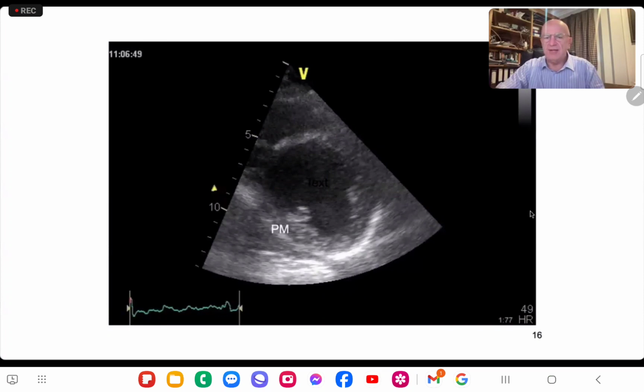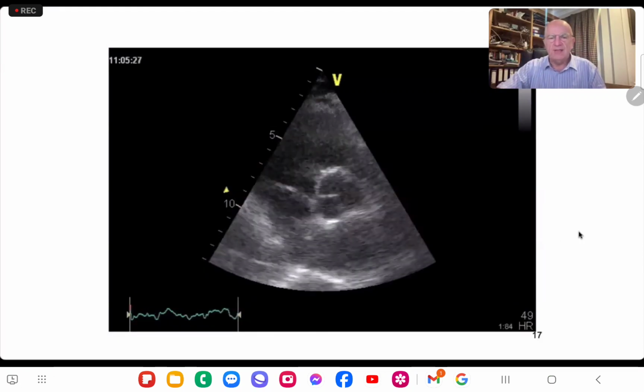You've also got to be able to identify which papillary muscle is which. So posteromedial, anterolateral. If you're struggling to remember which direction is posteromedial and anterolateral on a transthoracic echo, just think of your dad, because it's across the screen. It reads P for posteromedial, then A for anterolateral. It reads Pa, your dad. So you can either figure out the geometry, or you can just remember your dad, which one's which.